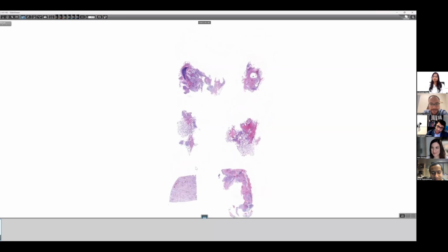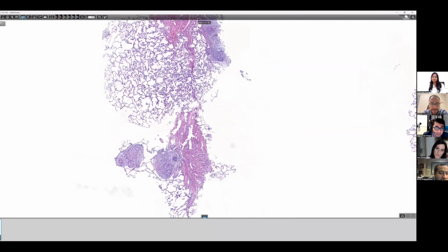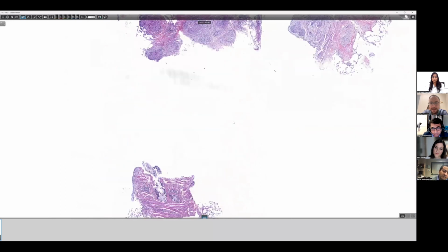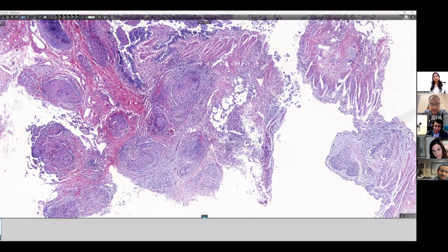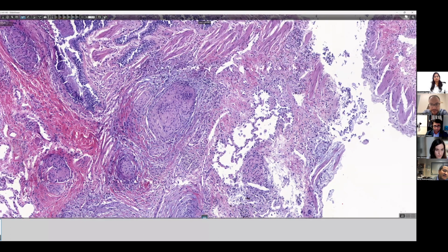Sounds great. Well, Matt, these look like great pieces of lung parenchyma, pretty substantial, and there are some focal abnormalities, where even at this low power you can pick out granulomas. They look non-necrotizing. With the history you gave, the first thing that comes to mind is HP, but these granulomas don't look like what I would expect in HP. They look more sarcoidal to me, because there's a paucity of inflammatory cells associated with them. They're tight, well formed, and very easy to see at low power. HP is in the differential, hypersensitivity pneumonitis, but I would be more worried about sarcoidosis.